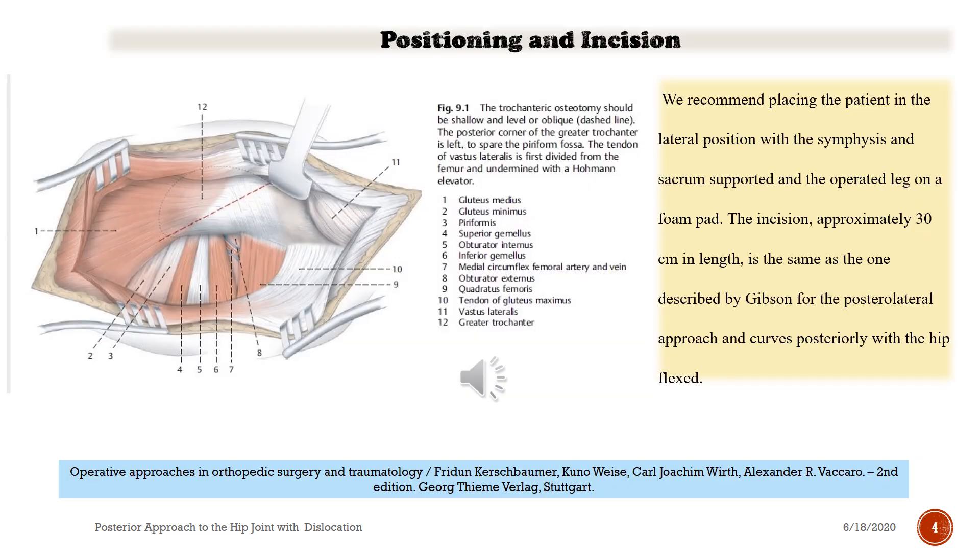Positioning of the patient: we recommend placing the patient in the lateral position, with the symphysis and the sacrum supported and the operated leg on a foam pad. The incision, approximately 30 centimeters in length, is the same as described by Gibson for the posterolateral approach and curves posteriorly with the hip flexed.